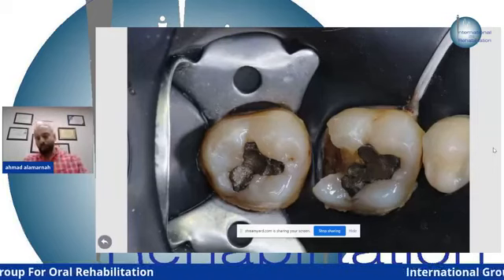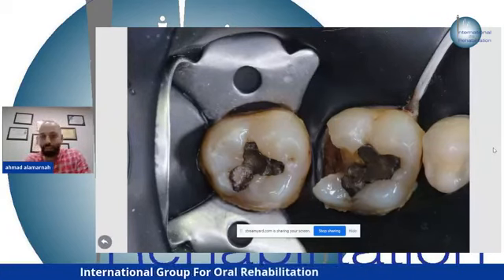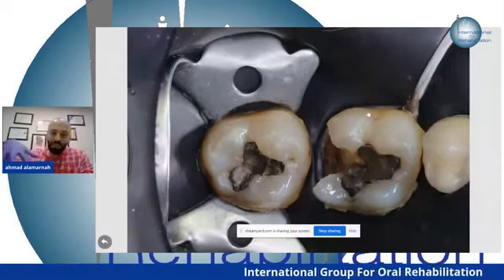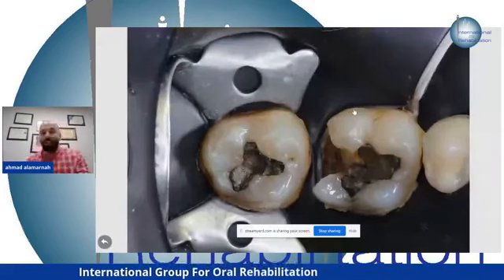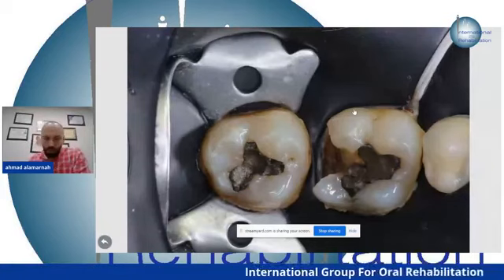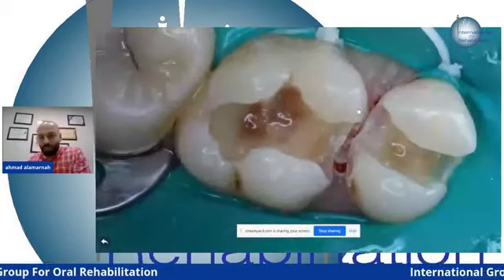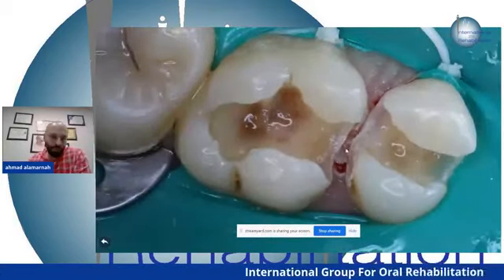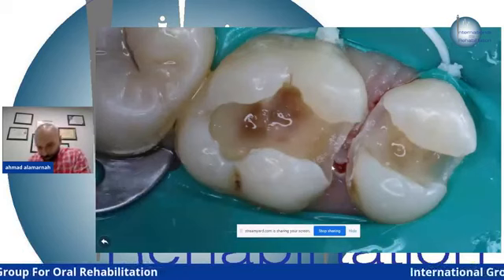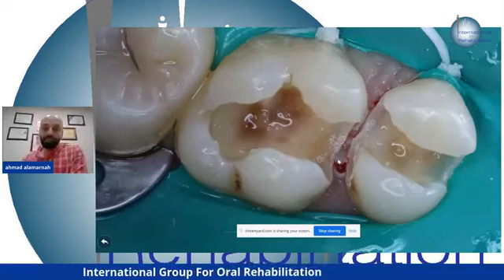And in this picture, I will speak about it later, I use the floss. If you see it, the floss on the 6, I will point it here. It will help you to envelope the rubber dam inside the sulcus and expose more of the tooth structure. But when I first used the rubber dam, I always had some problems. I think everyone who used rubber dam has them: the tear of the rubber dam, and also the injury of the interdental papilla.